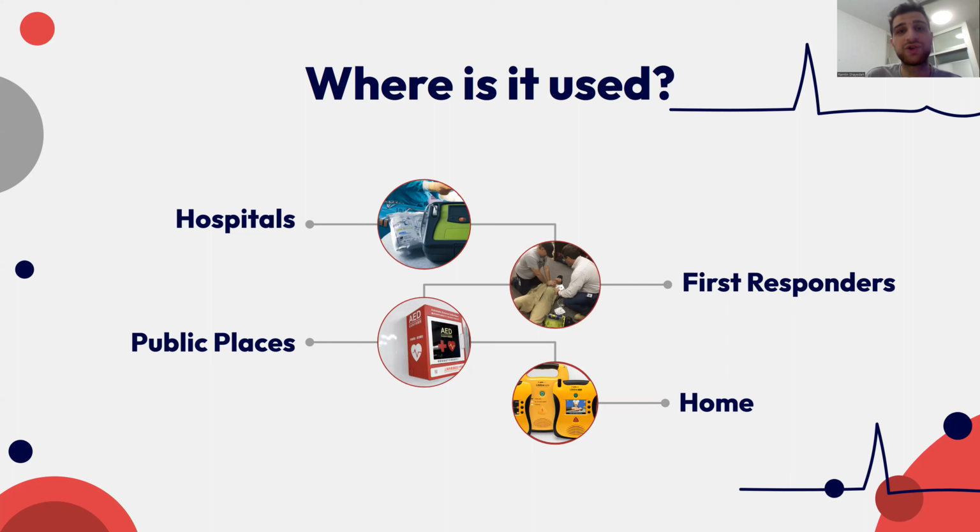If an individual is going through cardiac arrest, time is of the essence because every minute the chances of survival will decrease by 7 to 10%. High-risk individuals such as the elderly and also patients who have a history of heart disease are advised to have a home kit AED.